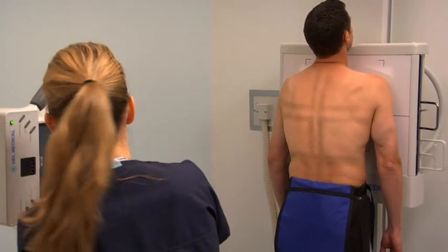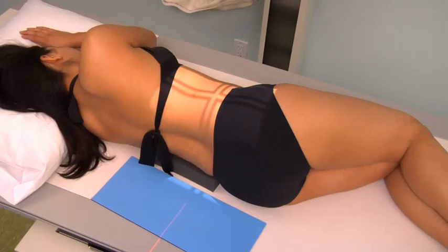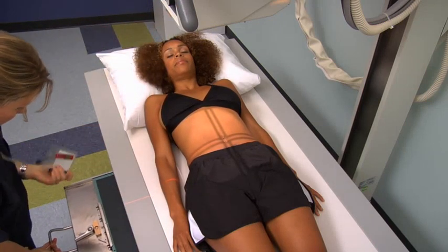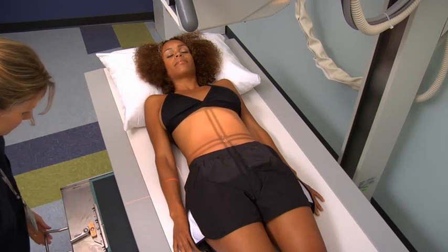A skeletal survey is a series of projections of the large bones in the body such as the bones in the chest, long bones, skull, spine, and pelvis. The survey is commonly completed for multiple myeloma, metabolic disorders, and non-accidental injury, or NAI.